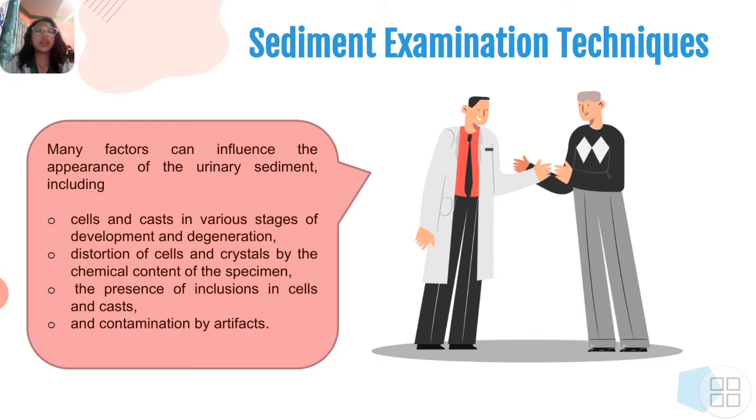Sediment examination techniques. Many factors can influence the appearance of urinary sediment, including cells and casts in various stages of development and degeneration, distortion of cells and crystals by the chemical content of the specimen, the presence of inclusions in cells and casts, and contamination by artifacts.